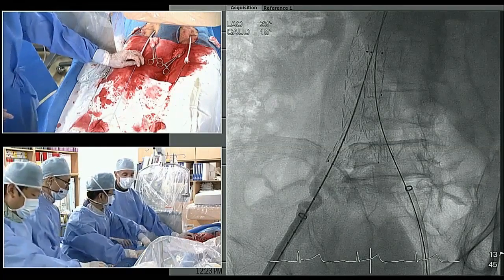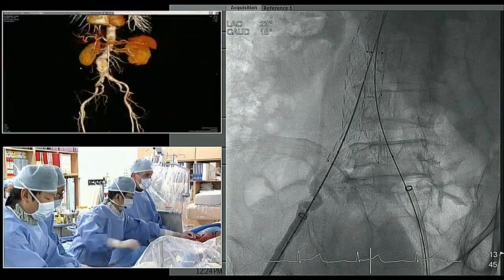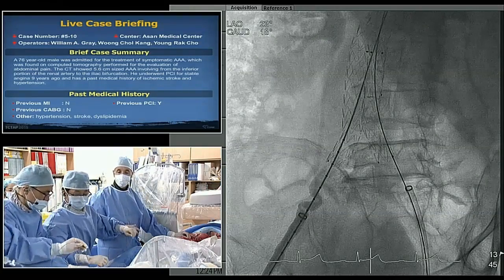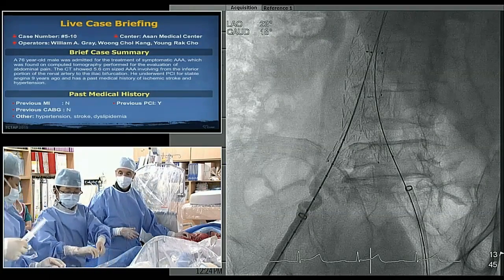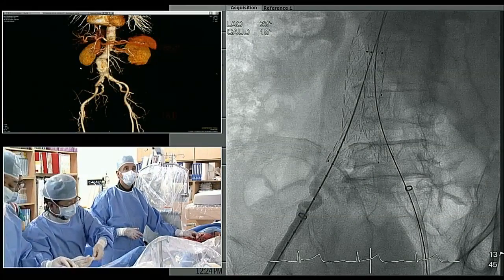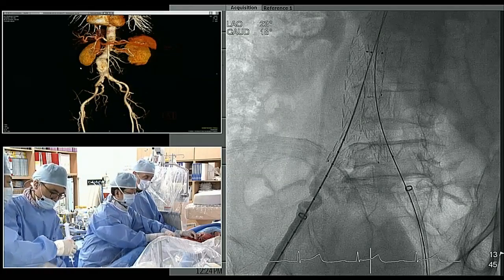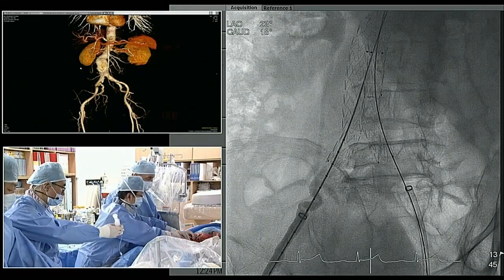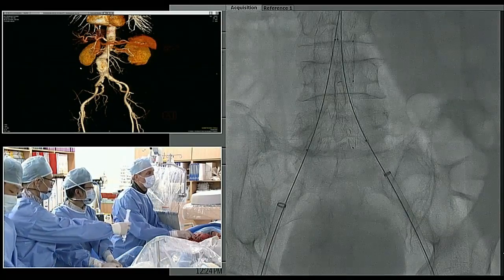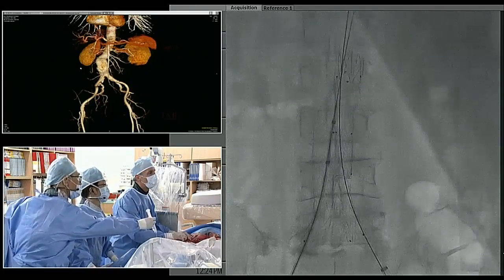You know, I think it's been said before at other meetings, but in Asia, it's more common to have a fairly short common iliac as compared to Caucasian U.S. patients, for sure. The anatomy overall, the entire length tends to be shorter, but especially the common iliac bifurcation length. So I try not to push that issue too much. I think we have plenty of coverage here. I would agree. All right, let's go up here and hit the top.